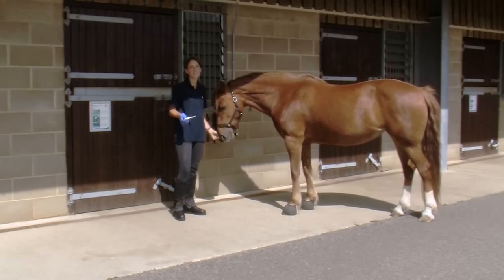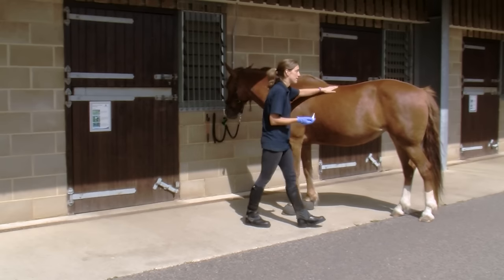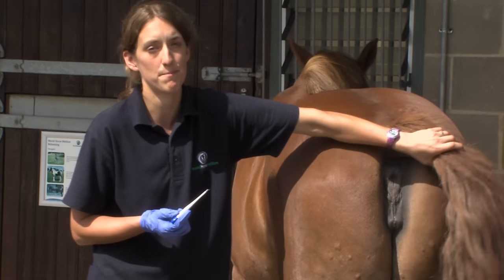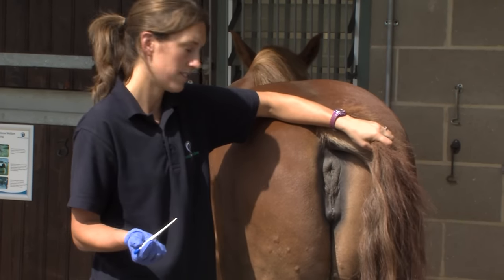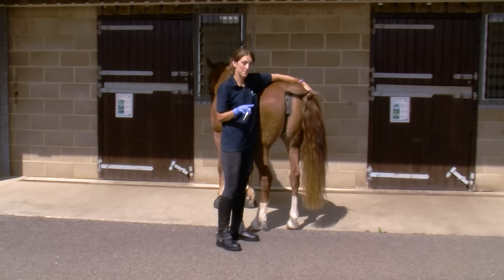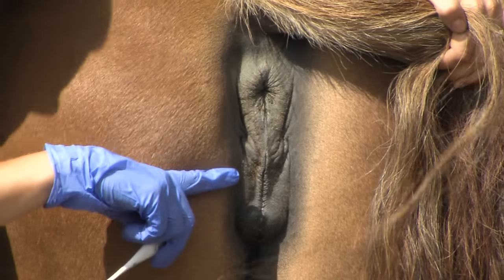So I'm now going to take Honey's temperature and show you how I would do it. I'd approach her at the shoulder, and then moving down the body I would take hold of her tail with my left hand and push it away from me. This gives me a really clear look of where I'm hoping to insert the thermometer. With geldings and stallions it's a little bit more obvious, but Honey's a mare so it's really important to make sure we put it in the right place — her anus, which is the opening at the top, and not the one underneath.